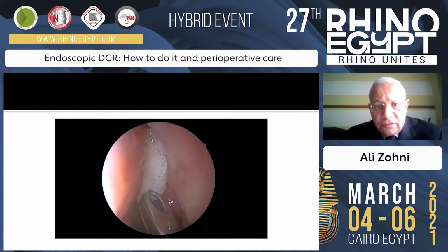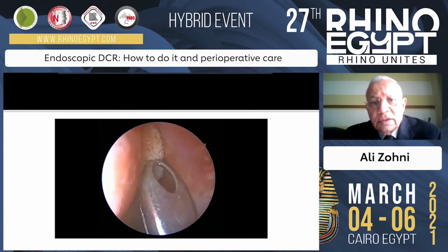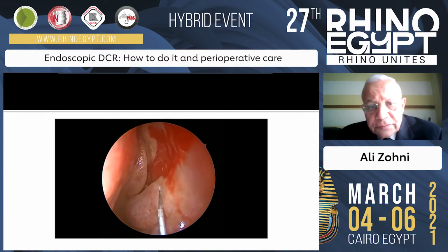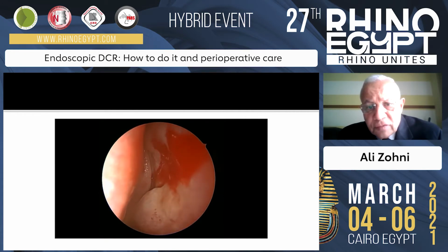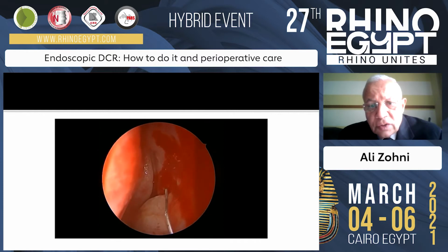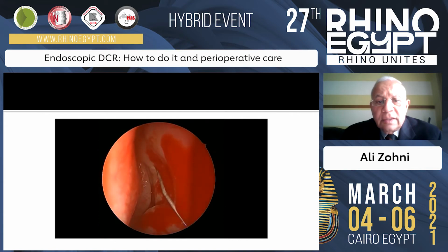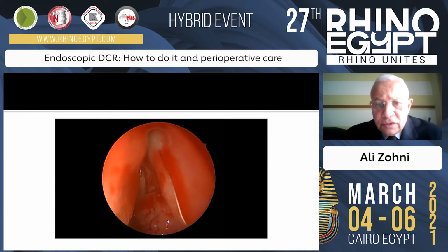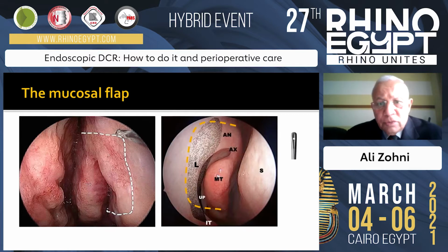The application of surface anesthesia and injection is used with Gelfoam, Merocel, or cottonoids, with gentle manipulation of the surface in order to avoid induction of bleeding. We inject along the prominence of the lacrimal sac and duct. We inject the maxillary line and the axilla of the middle turbinate, and sometimes we inject the upper surface of the inferior turbinate.